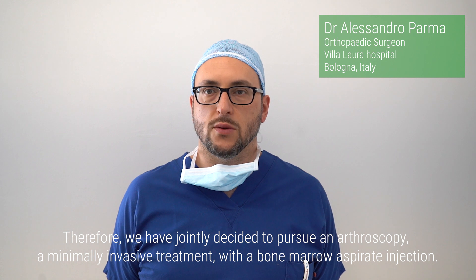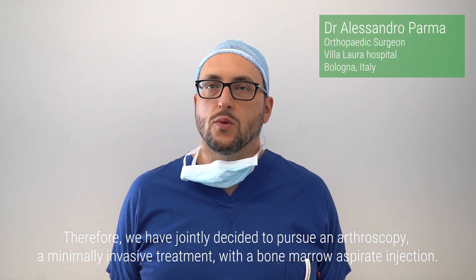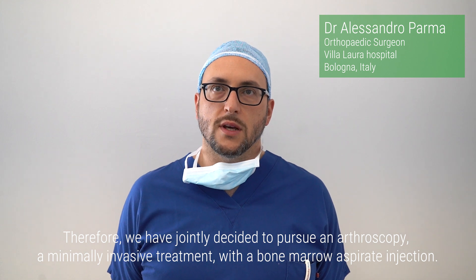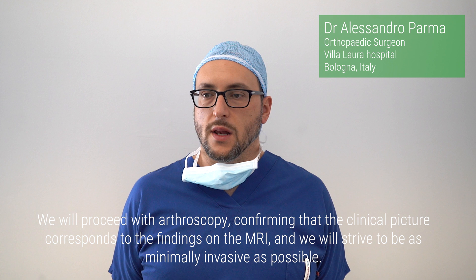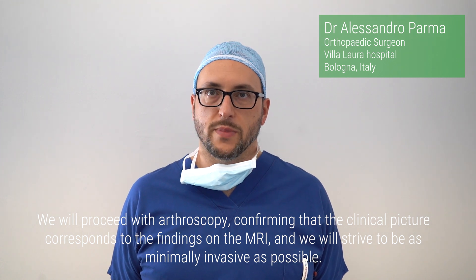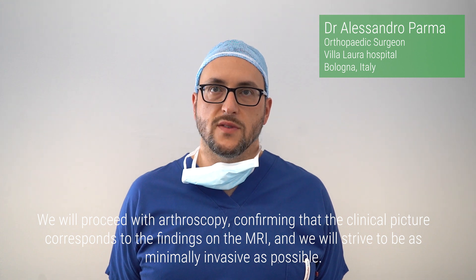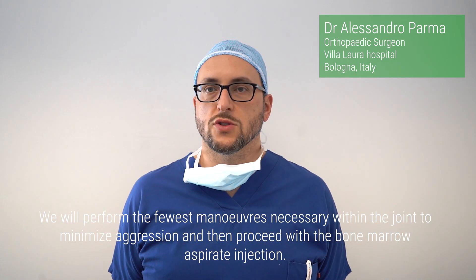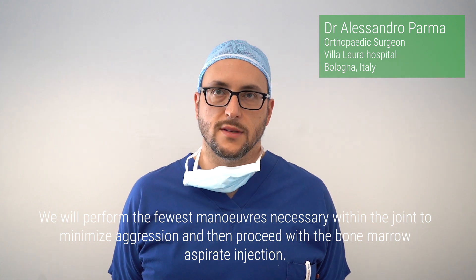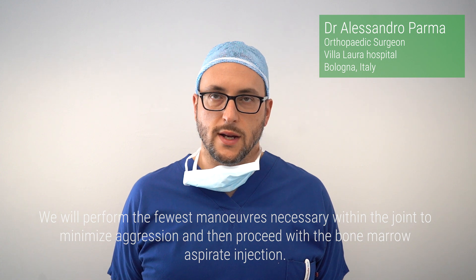Therefore, we have jointly decided to pursue an arthroscopy, a minimally invasive treatment, with a bone marrow aspirate injection. We will proceed with arthroscopy, confirming that the clinical picture corresponds to the findings on the MRI, and we will strive to be as minimally invasive as possible. We will perform the fewest maneuvers necessary within the joint to minimize aggression, and then proceed with the bone marrow aspirate injection.